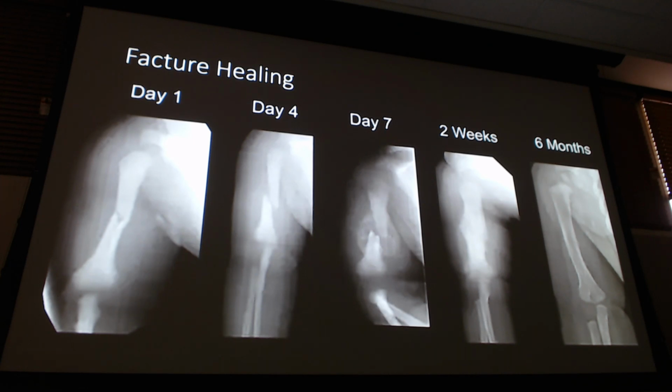This is a perfect example of why I say I'm not going to expect you to fully interpret pediatric x-rays, because where the heck are the growth plates? They're not there yet. The epiphyses haven't formed yet, right? Pediatrics is tricky. Now, in the grand scheme of things, you're going to know if it's a pediatric, because hopefully you ordered the dang x-ray, so you saw the kid first, right? But this is why when it comes to fractures and stuff like that, I'm not throwing pediatric x-rays at you, because they're tricky. There are no epiphyses in here because this kid is too young. They haven't started to form yet.